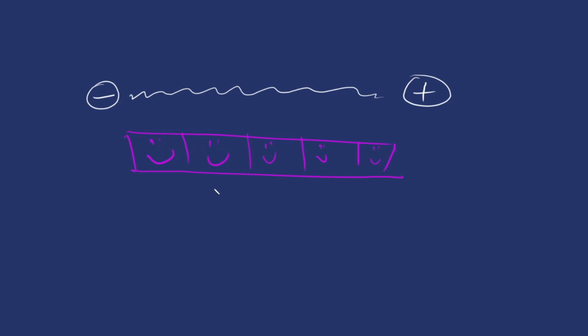What's going to happen is the plus and minus, these two electrodes, they pick up on the wave of depolarization, or that movement of depolarization. So when these guys wave their arms up and they're like, yay, it's time to party, right? And they go to the next guy and the next guy, so they're moving this way in this case.